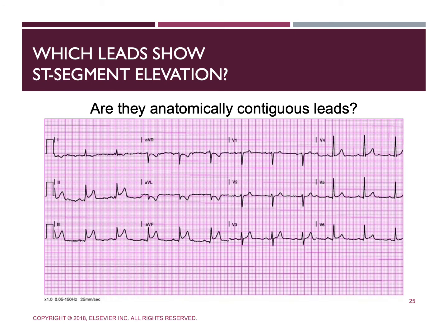So what you're looking at here is another figure, and what we're going to be looking at is which of these leads show ST segment elevation, and are they anatomically contiguous leads. So what I want you to do is look at this ECG. You can pause this video for a second to study it in detail and see if you can answer these questions. And on the next slide, we're going to go over the answers.